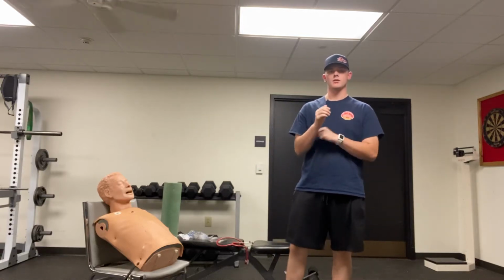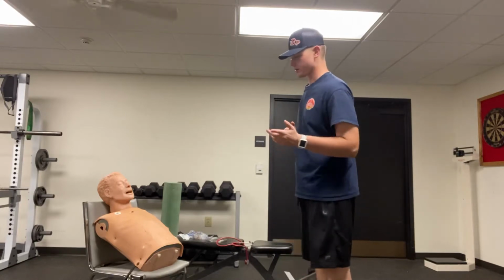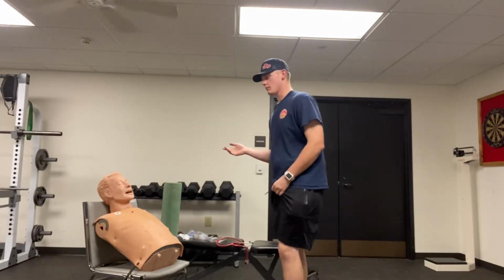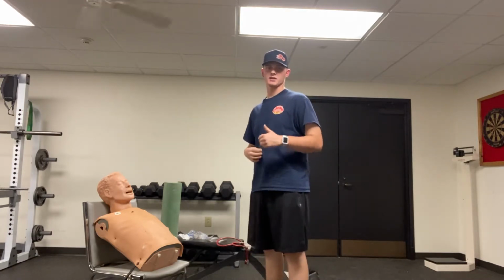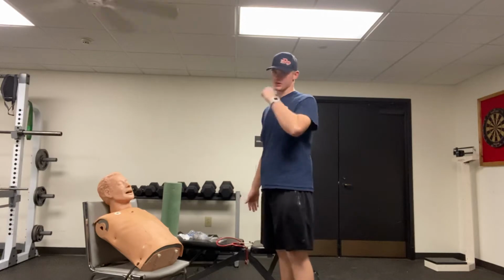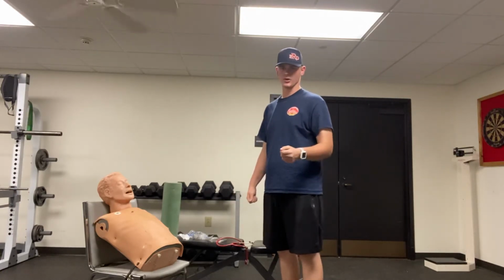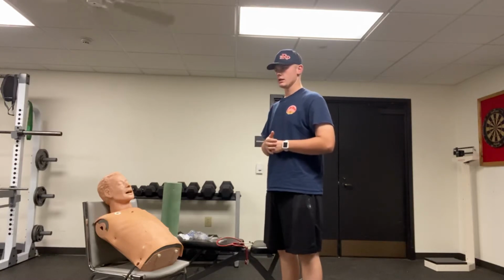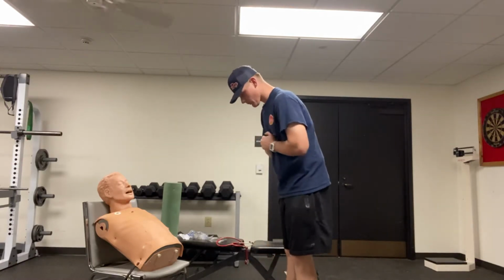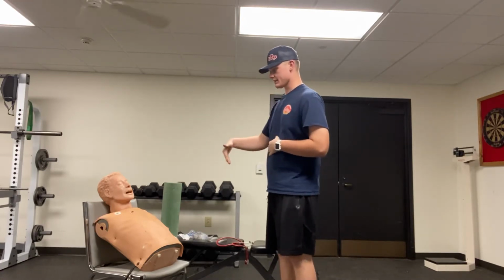Administration. So BSI, scene safety, or standard precautions. I'm going to come up to my patient, who is probably going to be in some type of respiratory distress. I know that I'm going to be administering some type of medication, whether it's albuterol or ipratropium bromide, which is Atrovent. What I'm going to do is assess his work of breathing.